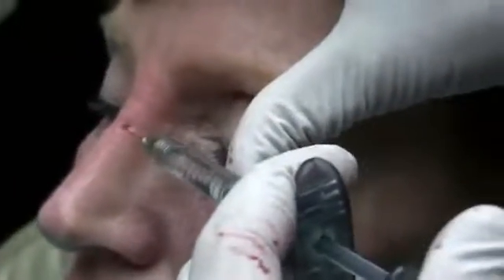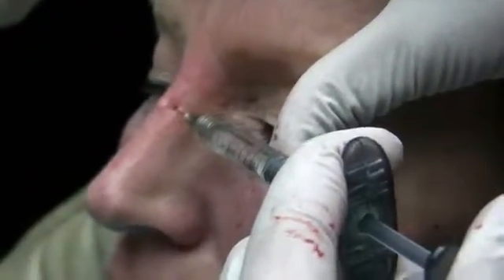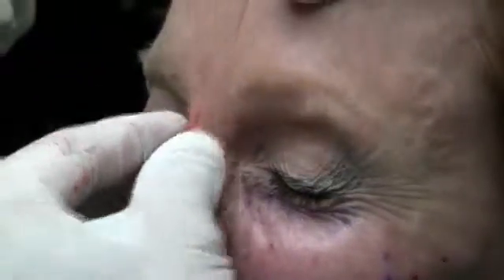And it's a very malleable area. And there's a little hematoma that's in the making right there. I guarantee you that's a guaranteed bruise, so we need to compress this. And we'll do the same on the other side.